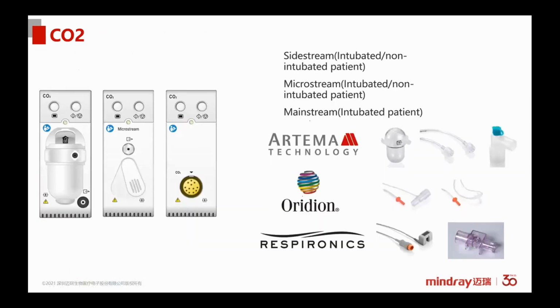Okay, next module is for the CO2 module. CO2 monitoring, we have 3 types of CO2 monitoring in Mindray products. They are side stream, micro stream, and mainstream module. It is used to monitor the respiratory status of patients and guide their ventilation.